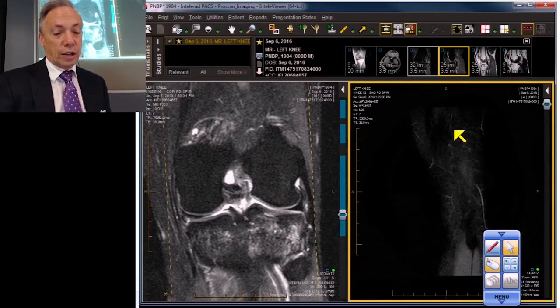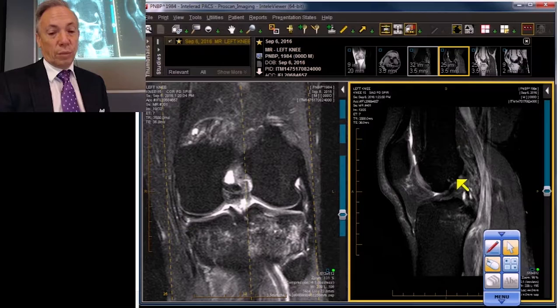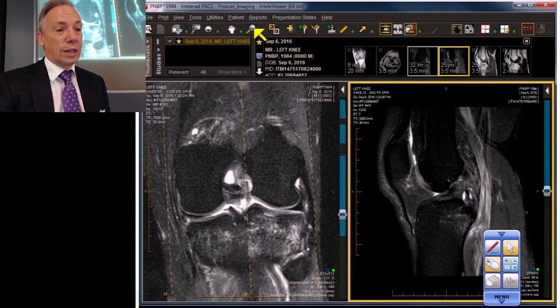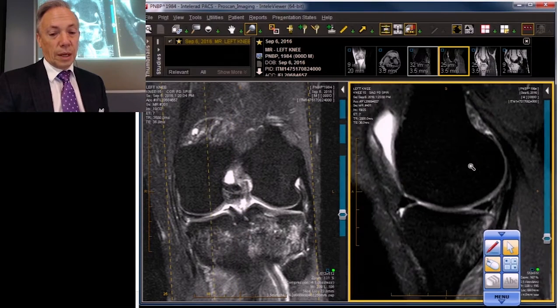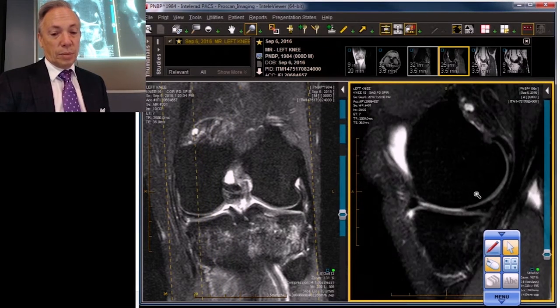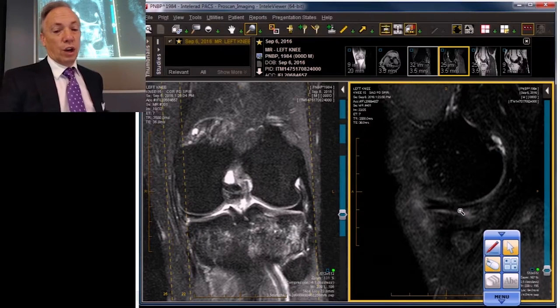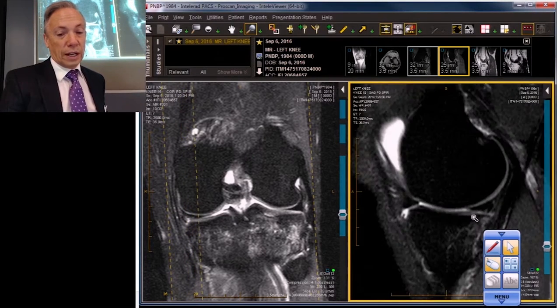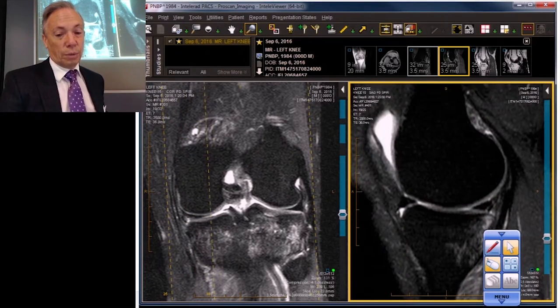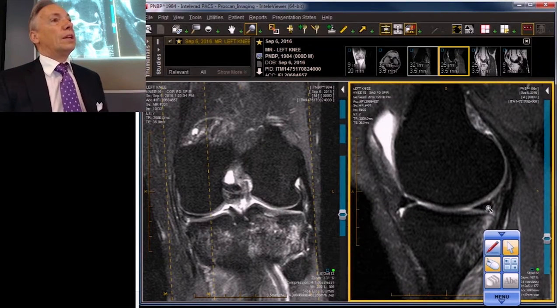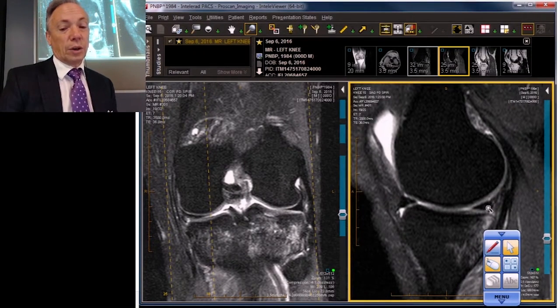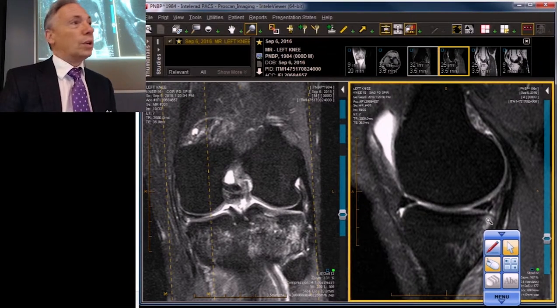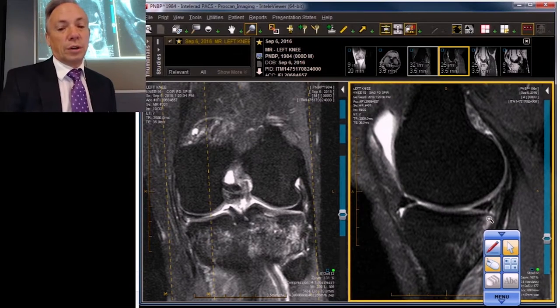Let's look at the sagittal projection. We'll reaffirm our anterior cruciate ligament tear, although that's not why we're here. There is our fairly large tear, and here is our meniscus tear, which we said was rather complex. It had an oblique or horizontal component, and then it continues on with a little tiny vertical component, which is so common in these pivot shifts. This signal will be there forever — it is going to sit directly atop the meniscal contusion. So you don't want to get too excited about these when you see them a year or two later.